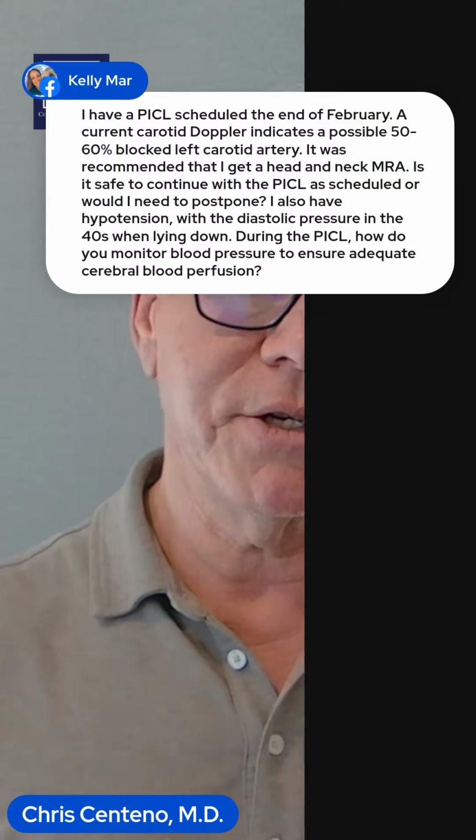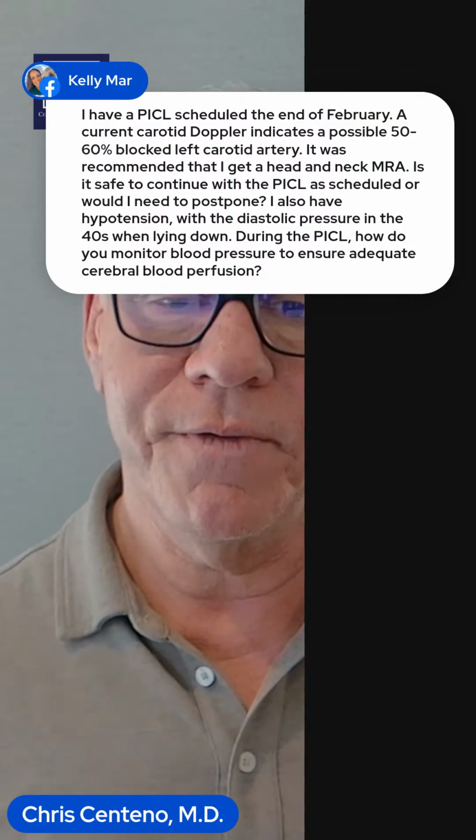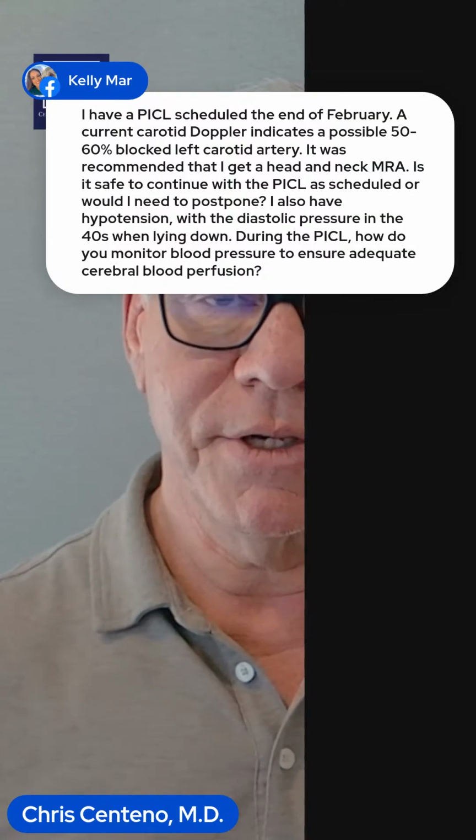We measure blood pressure. The procedure is done under anesthesia, so we're measuring blood pressure, heart rate, oxygen perfusion constantly during the procedure.